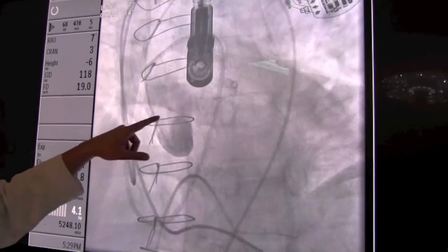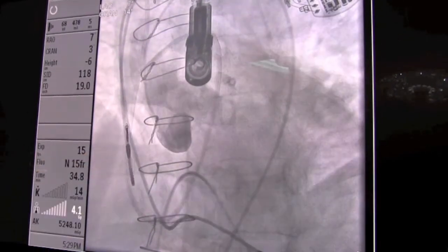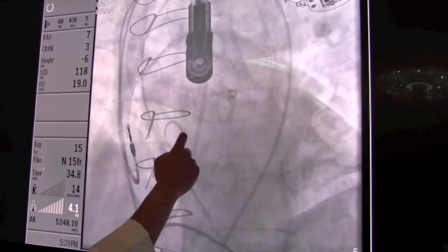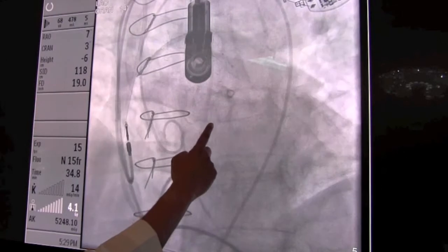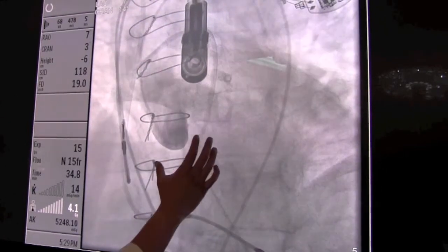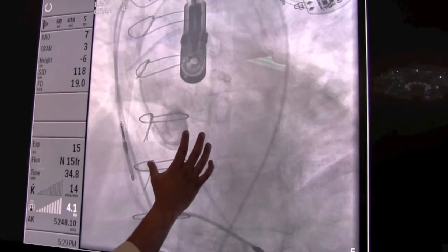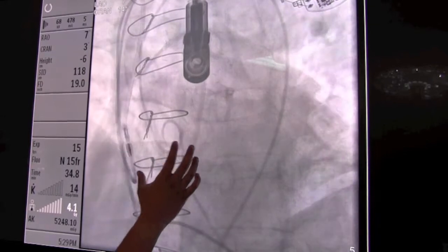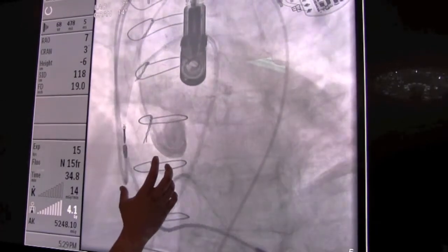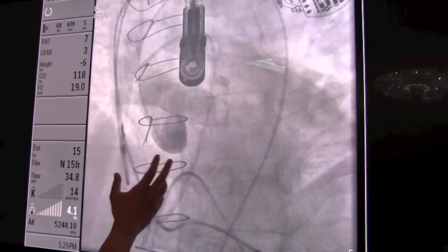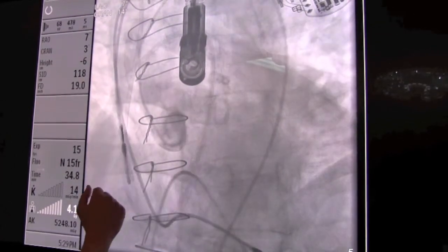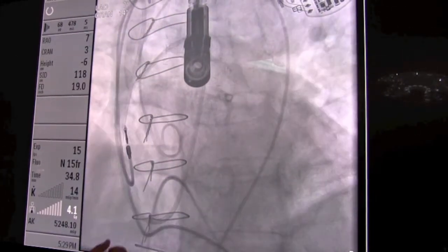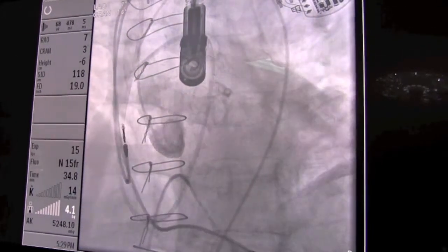Then we took a picture of the patient's aortic valve, and you can see here that the valve is heavily calcified and it's not moving. This is a picture taken in the angle that the software program predicted we'll use later to position the artificial heart valve that we're going to place.